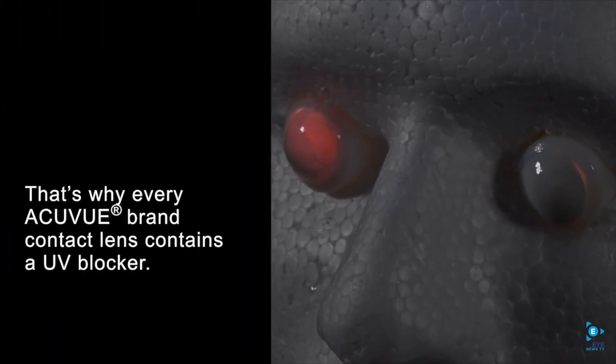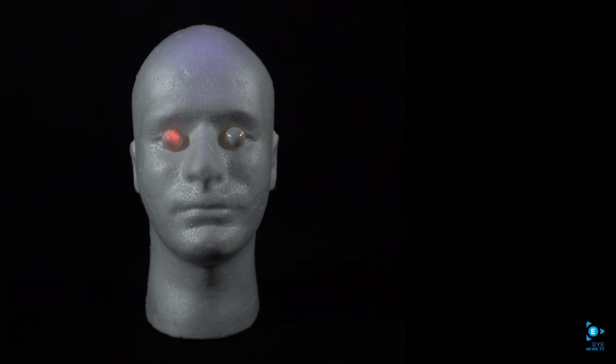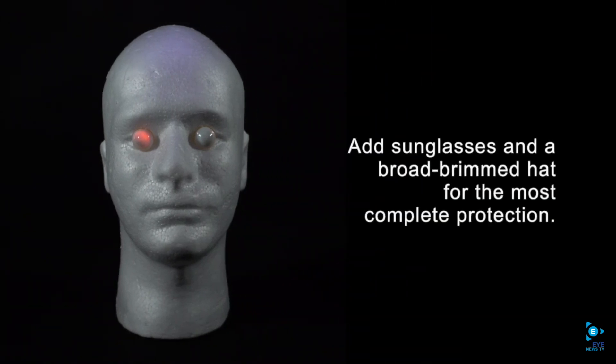That's why every AccuView brand contact lens contains a UV blocker. Now if you wear contact lenses, this is a great first layer of always-on protection. And then you can add sunglasses and a broad-brimmed hat for the most complete protection.